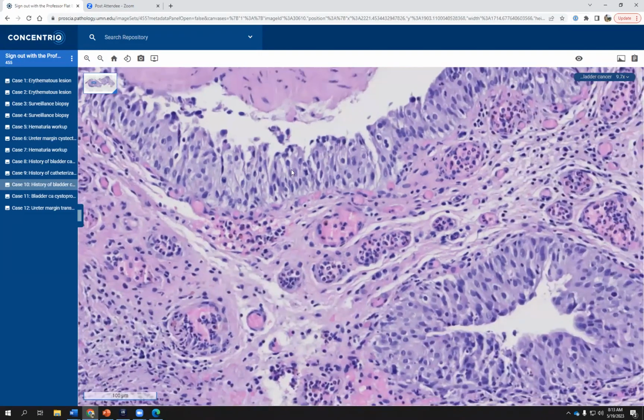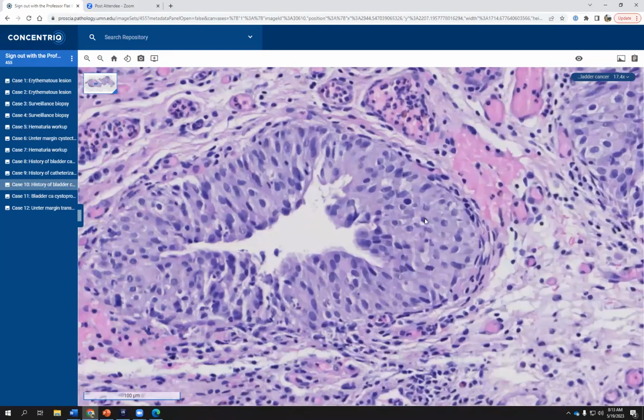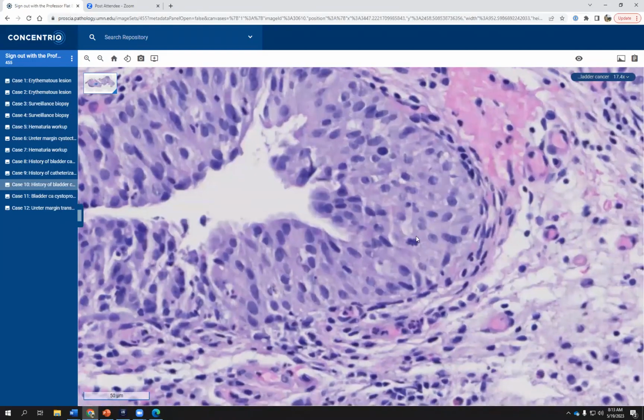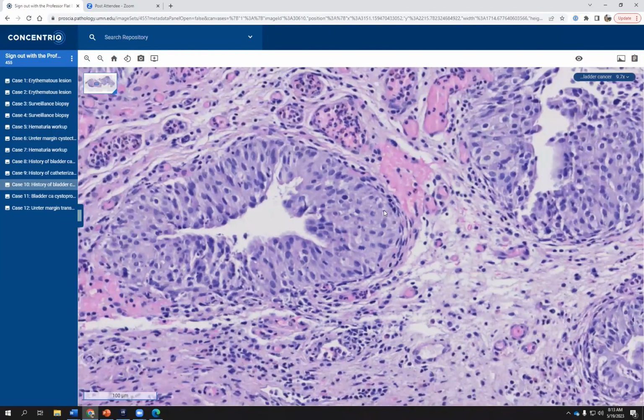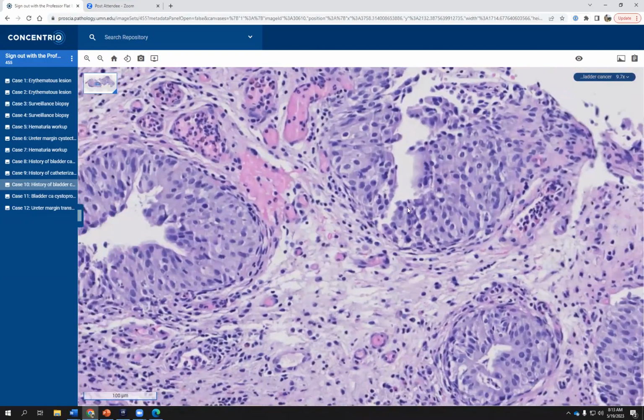So this becomes very concerning for carcinoma in situ. And we go to this fragment over here. Again, we see mitotic activity. We clearly see hyperchromasia, nuclear overlap, nuclear enlargement, and also some small nucleoli. And we also know this patient has a history of bladder cancer. So we begin to worry that this actually represents carcinoma in situ.